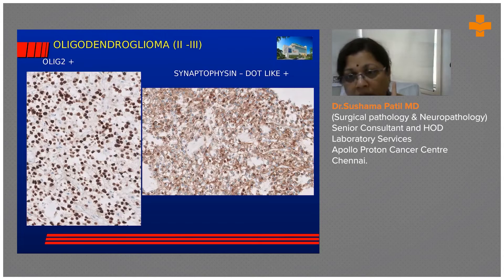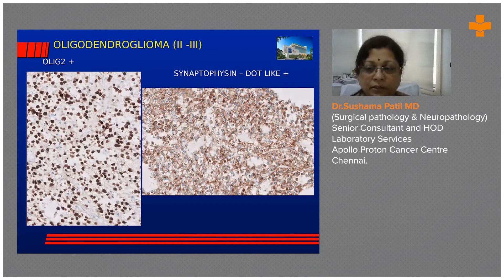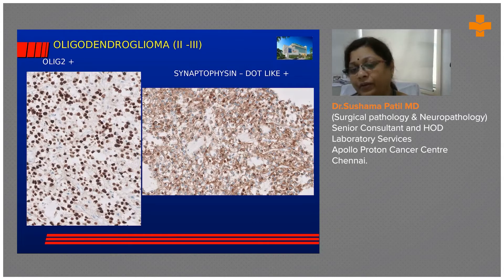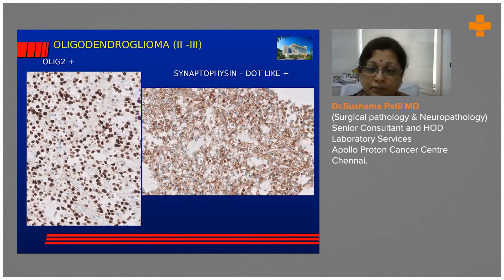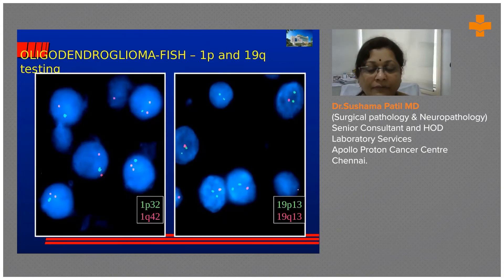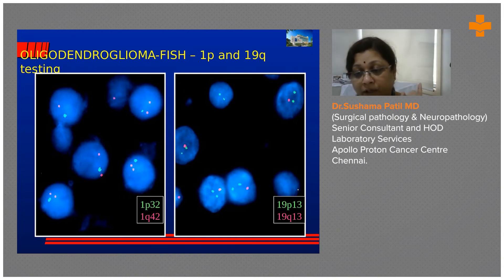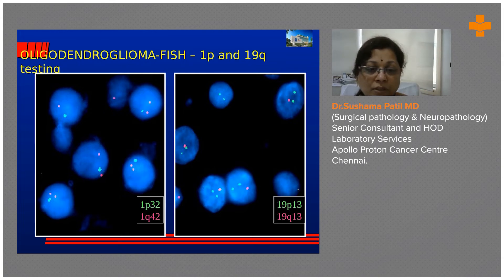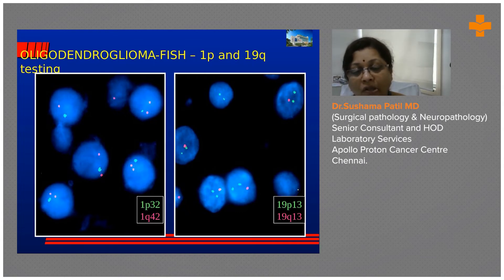Whenever I see that dot-like synaptophysin positivity in an oligodendroglioma, I am 100% certain it will be 1p/19q co-deleted. I don't fully know the correlation, but it consistently predicts co-deletion. If the FISH lab tells you it's negative, go discuss it with them — something is wrong with their system. On the FISH slide, the left side shows 1p and 1q: there are two reference probes but only one green signal for the test probe, meaning one 1p signal is lost — so 1p is deleted.